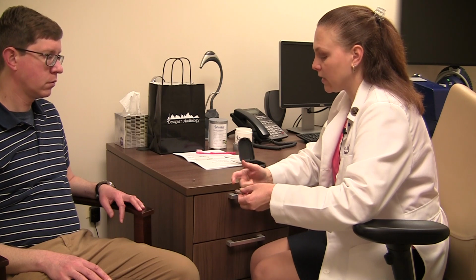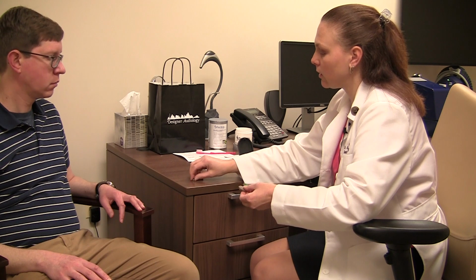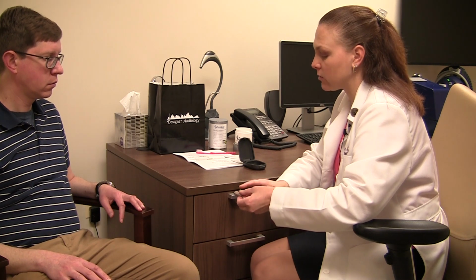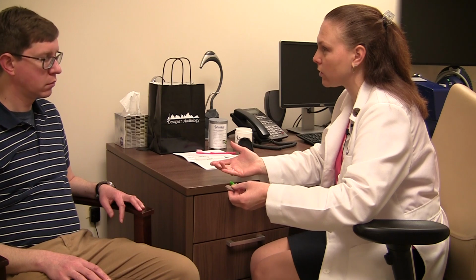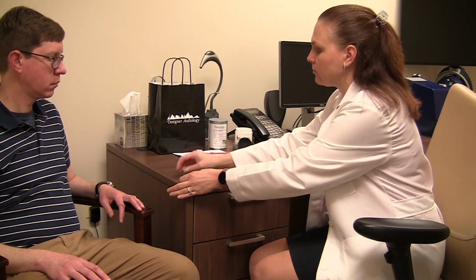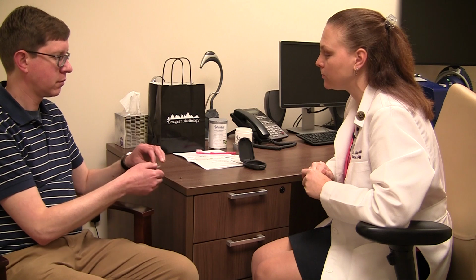The battery, like I said, is going to go into the door. And you can see there's a ring on the door and there's a ring on the battery. The ring on the door and the ring on the battery should touch each other. As long as the battery's in correctly, the door will close and then the hearing aid will turn on. If the battery is not working its way into the hearing aid easily, something's probably wrong. Take it out, start all over again to make sure you're doing it correctly. So I'm going to let you try just to make sure it feels comfortable.